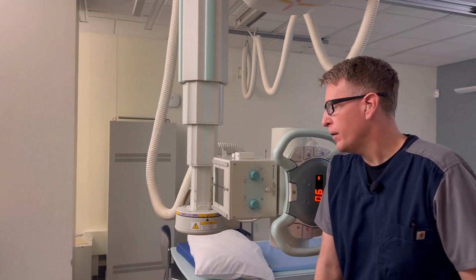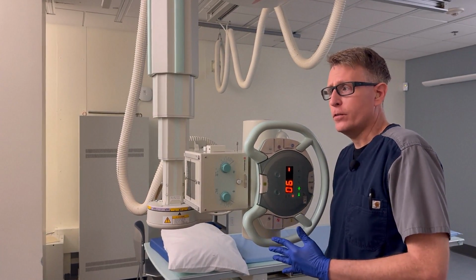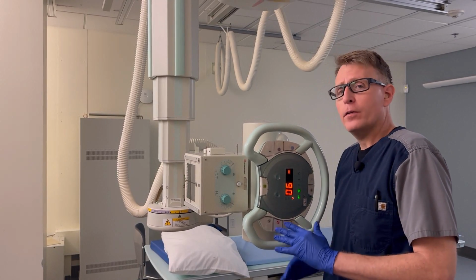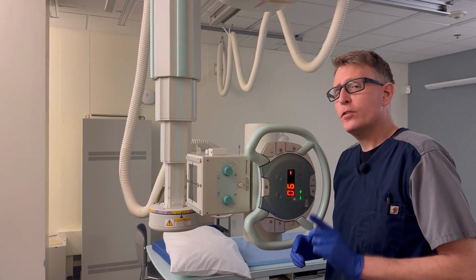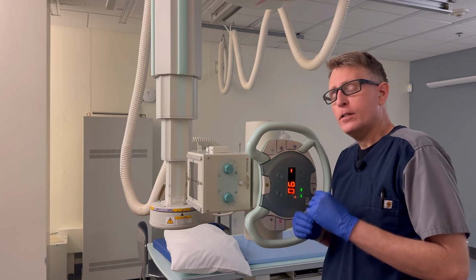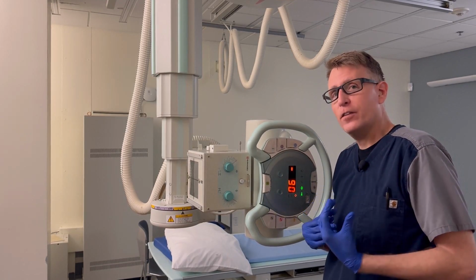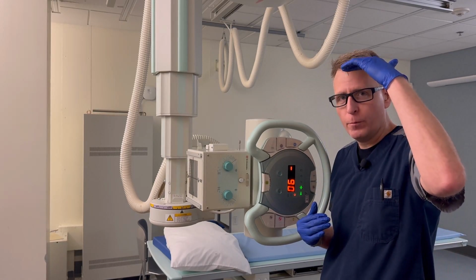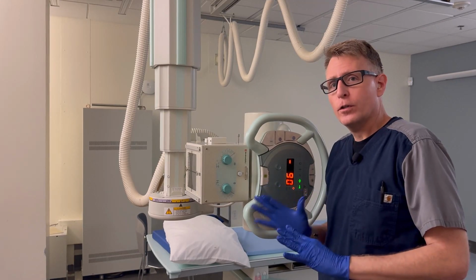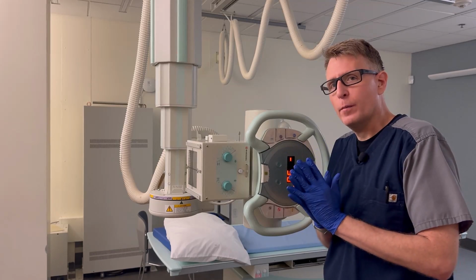So I've kept the same SID from my other two sinus projections. 72 inch will be fine for the lateral. And my same collimated field is a good starting point, but you need to look at your previous images and adapt the centering to frame a little bit. If your patient has very extensive frontal sinuses that go very high up the forehead, you might need to adjust your collimation a little bit.